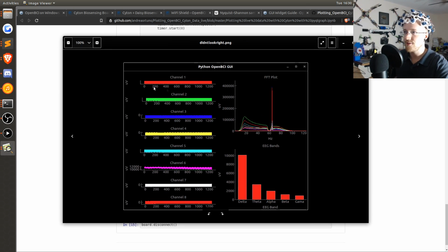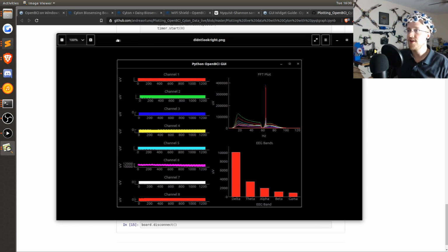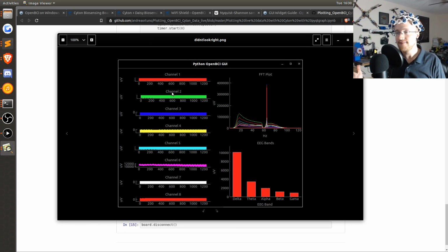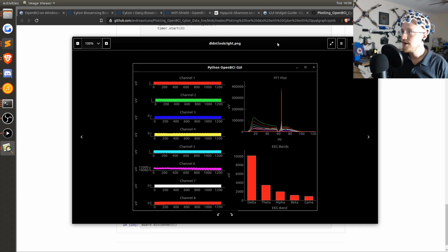Also, the channel data just looks wrong. I don't know what to think about that, but yet again, the recurring theme is I don't know how to fix it, right? Because I don't know what I'm looking at when I'm looking at this code, and it's going to probably take me months, maybe not months, weeks, but a while to figure out where something's going wrong, and hopefully I'm assuming it's nothing wrong with the headset. So there was that.